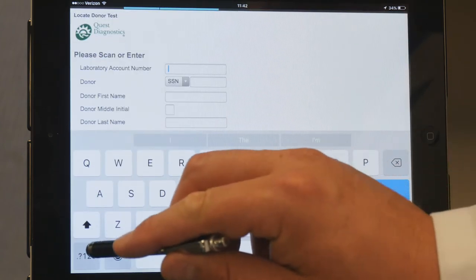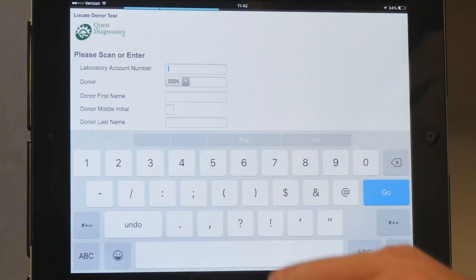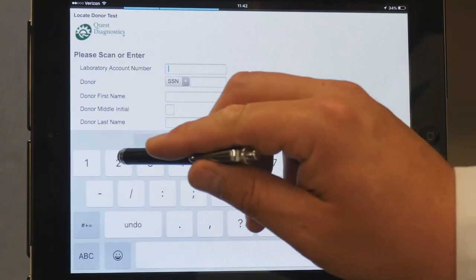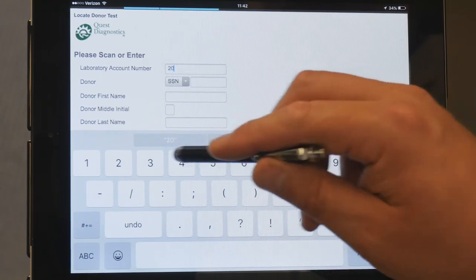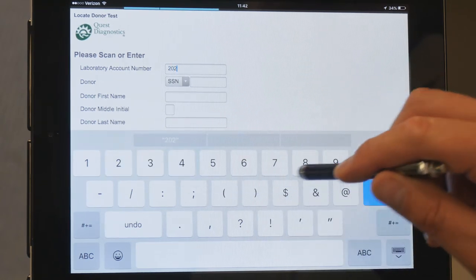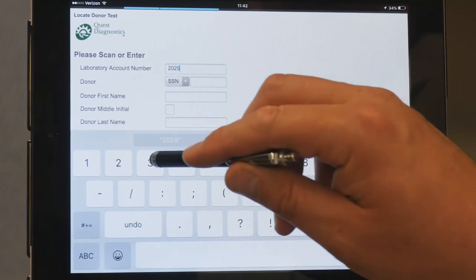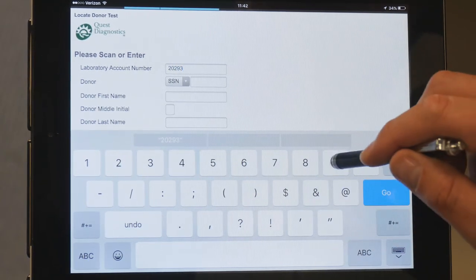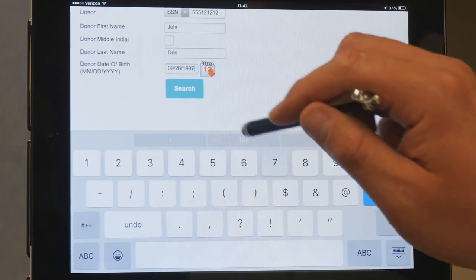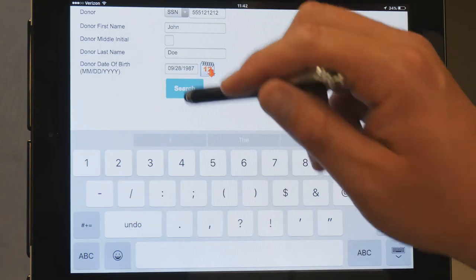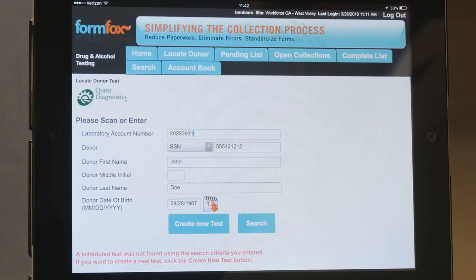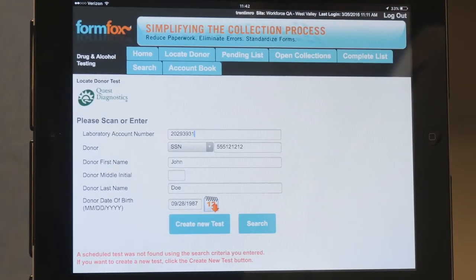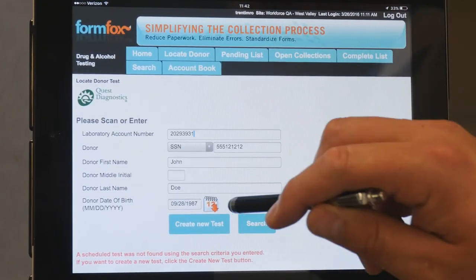The iPad virtual keyboard defaults to the alphabet characters. To type in numbers, tap the key in the bottom left-hand corner with numbers on it. Once all the fields are entered, tap Search. On the next screen, select Create New Test.